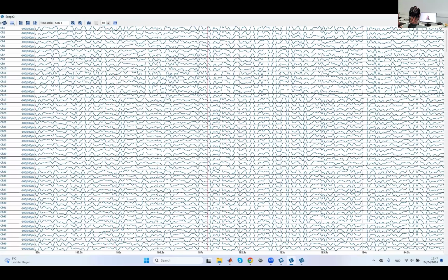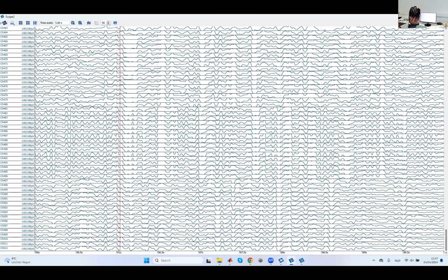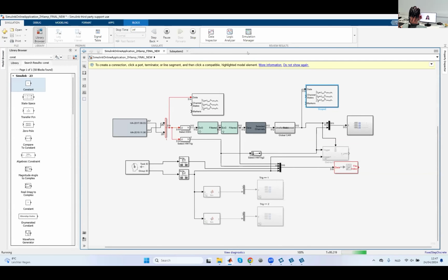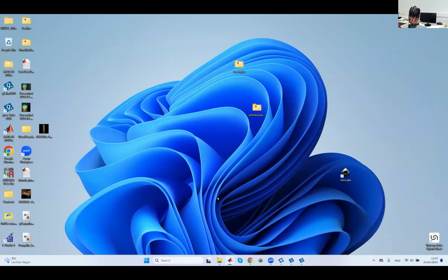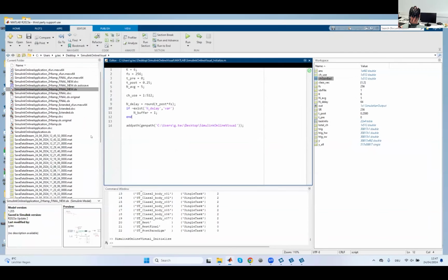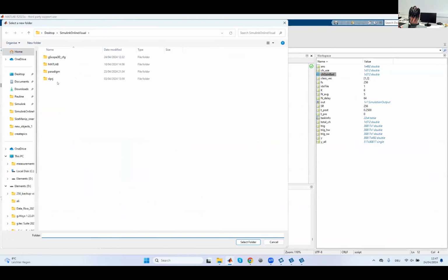Exactly. So these are all the 512 channels that we record with both of the g.HIAMPs. And maybe I can also show you, if I load the second paradigm, how these visual features look exactly like that I mentioned before. Meanwhile, as I'm loading it, you can proceed with answering questions, Christoph.